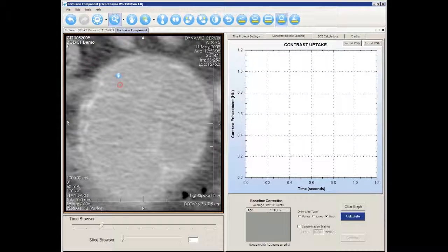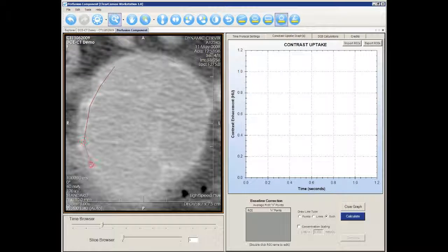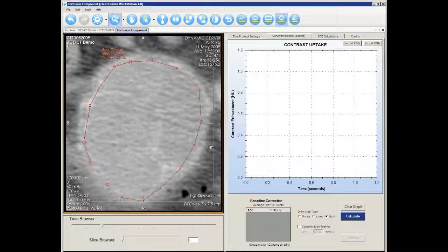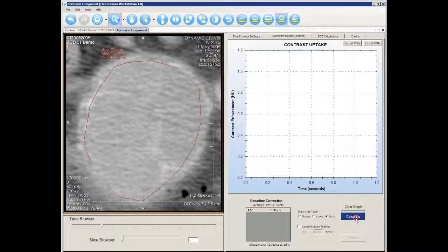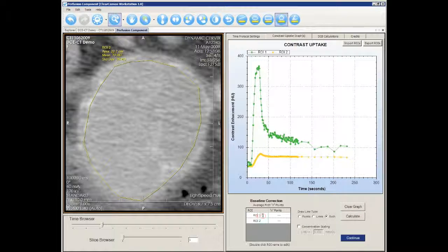We will do the same for the tumor. We can generate the contrast uptake curves by clicking the Calculate button. We can rename our region of interest.